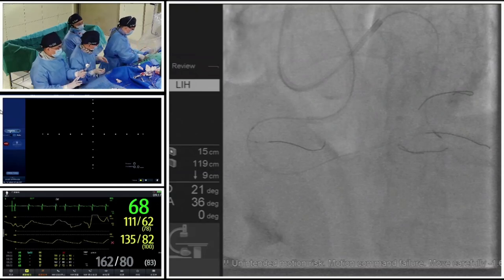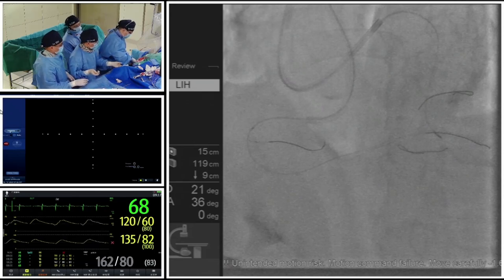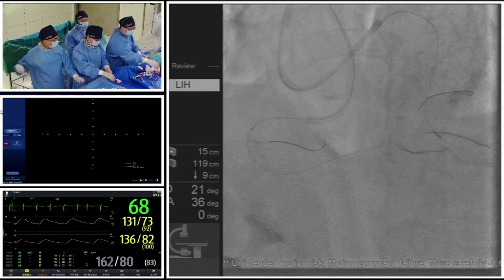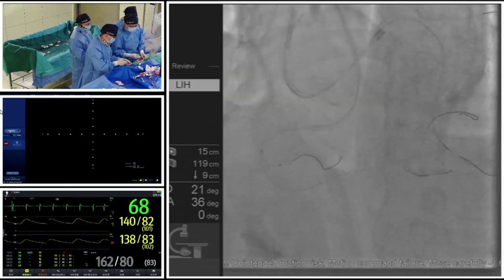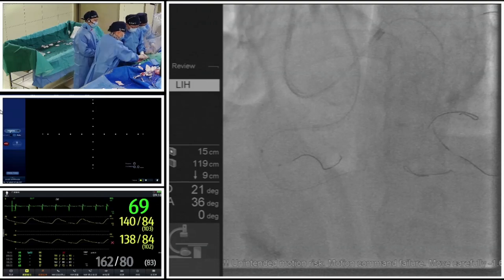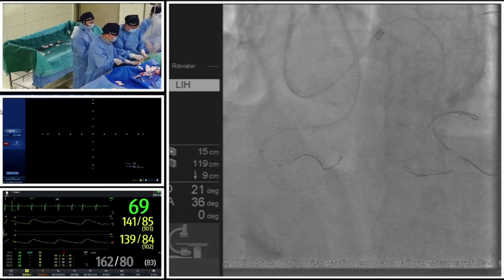And there are also studies performed by other professors mentioning that the composition of the plaque in the CTO segment is more complex compared to the non-CTO segment, which means that attenuated plaque and calcified plaque are relatively more often seen within the CTO segment. This forms a difficulty in passing these kinds of devices, although we have made some progress in the equipment and techniques of CTO procedures.